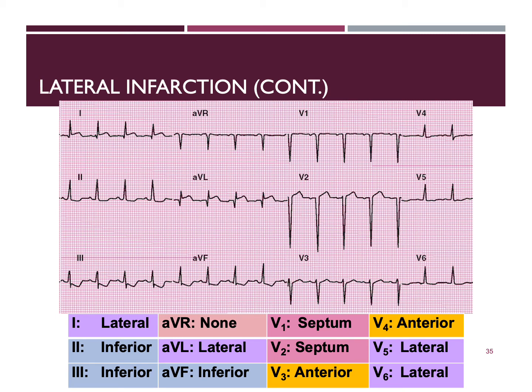A coronary arteriogram at the time also showed a blocked left anterior descending artery distal to its first large septal perforator. So the STE evolved and the T waves in all of the chest leads had become upright the day before this tracing was recorded.